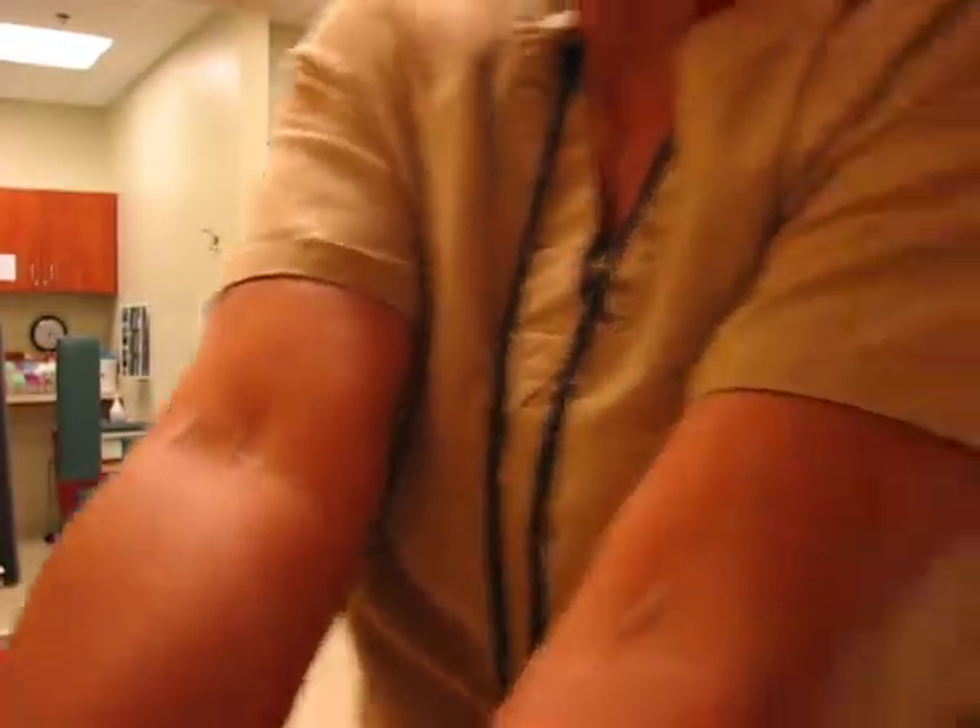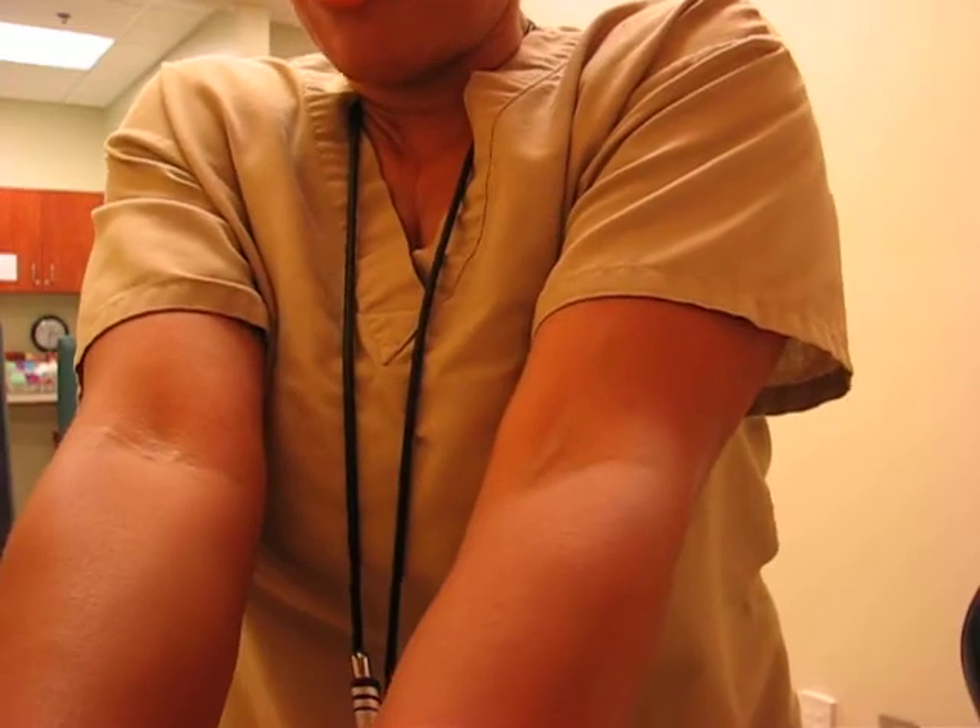You can kind of see my veins. But misconception — you see them, they're good? No. It's all about what you feel.